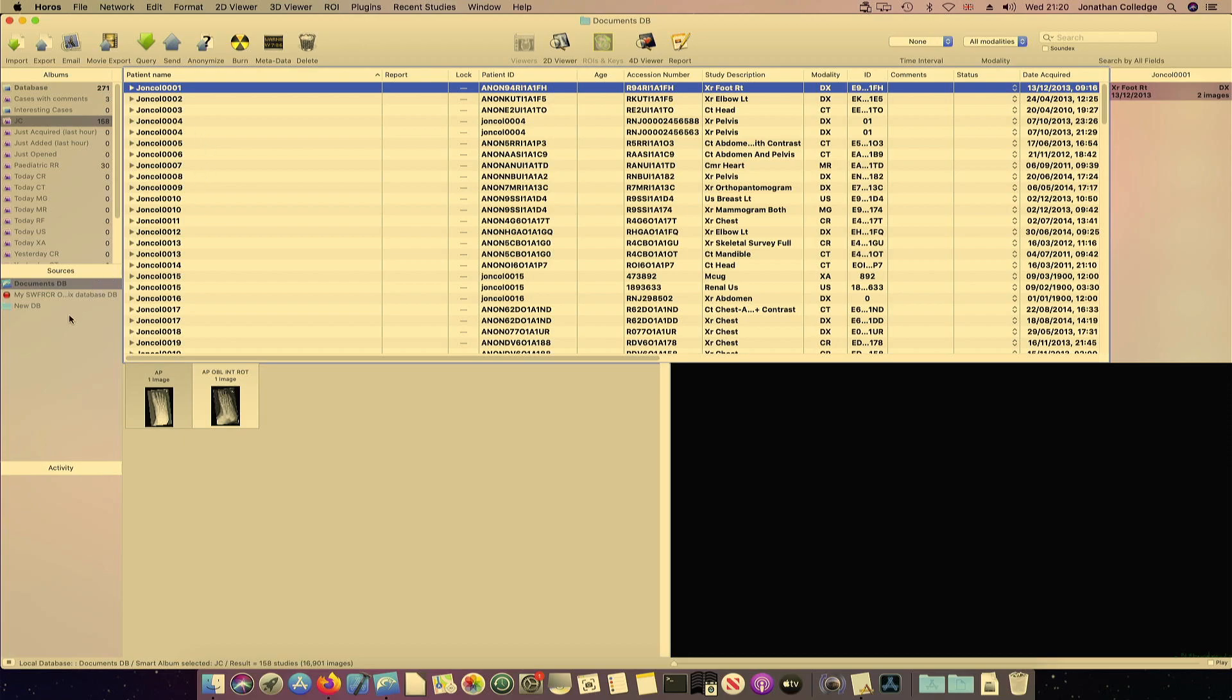If of course everyone hasn't done smart albums and has just used random anonymizations, then you might want to just make several new databases. Which is fairly inefficient but will still work very well.